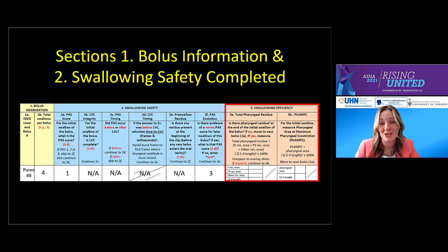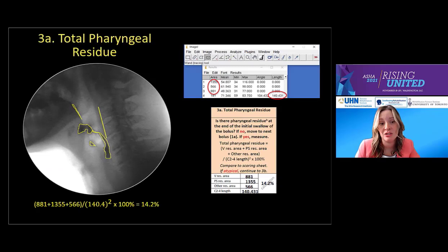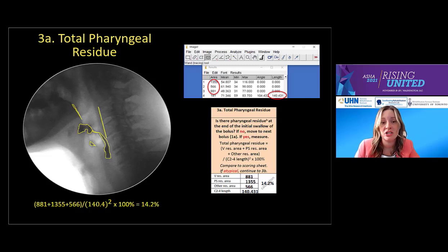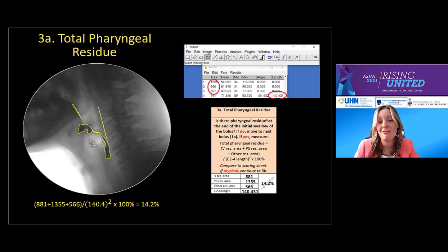We move on to swallowing efficiency — the third section in ASPECT-C, colored in peach. Specifically, 3A: total pharyngeal residue. It is clear that swallowing efficiency is a huge concern for this patient. Let's assess the extent of that impairment and try to understand potential mechanism. We see residue in the piriforms, the vallecula, and other areas such as the base of tongue. We use ImageJ to trace the residue. We measure the anterior inferior corner of C2 to C4 with the line tool, plug the values into the calculation on our worksheet, and that gives 14.2%, which is more than the typical reference value of 1.5% found on our scoring sheet.